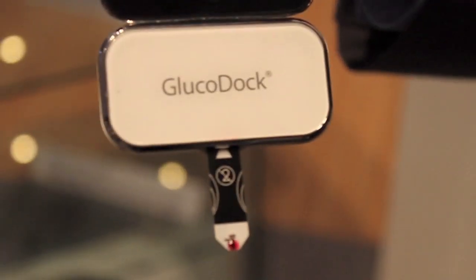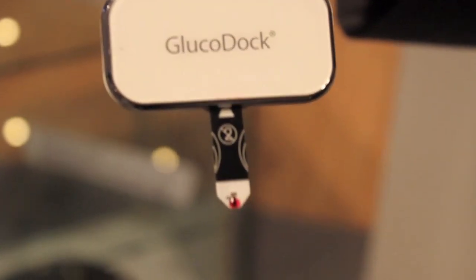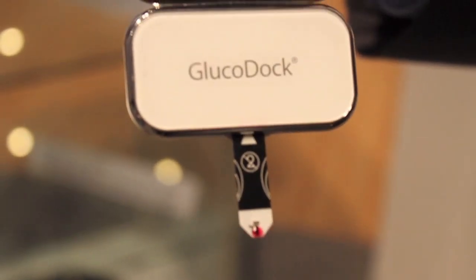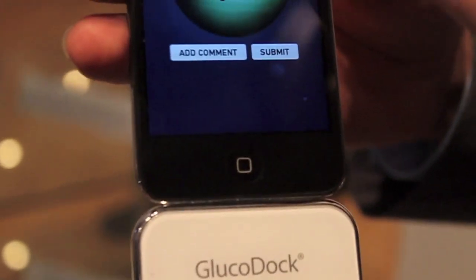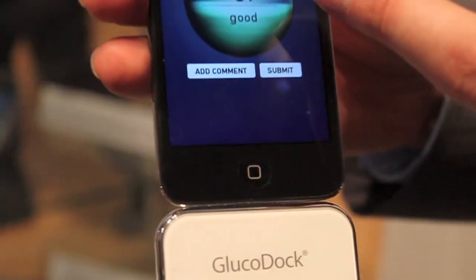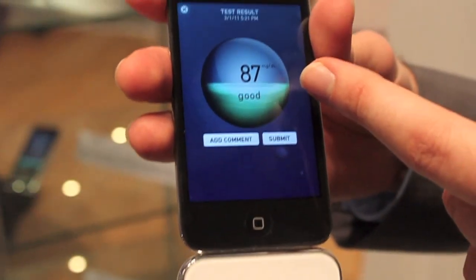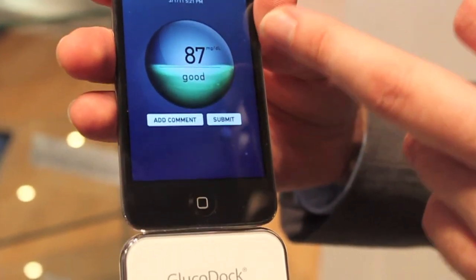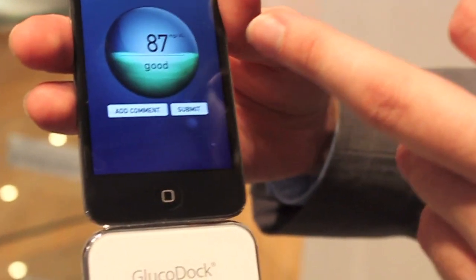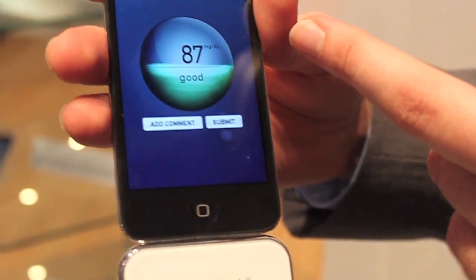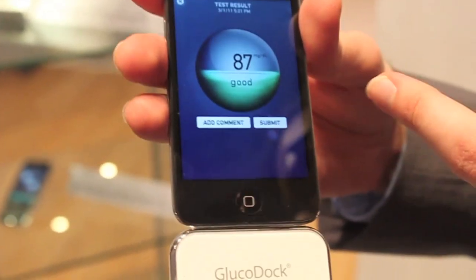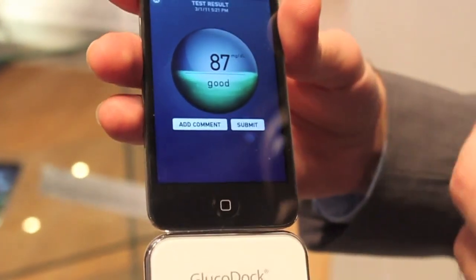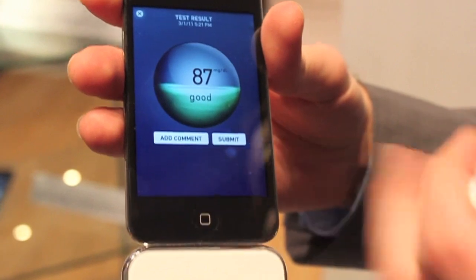Results above 120, for example, would be shown as high and in red. And if the result is below the target range, it would be blue and indicate low.